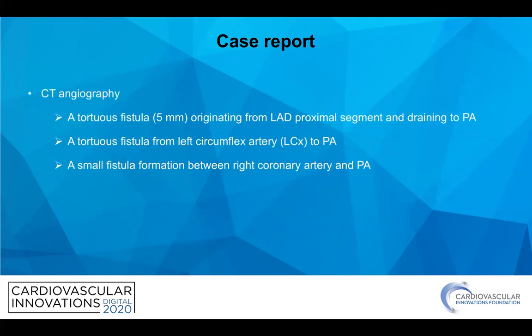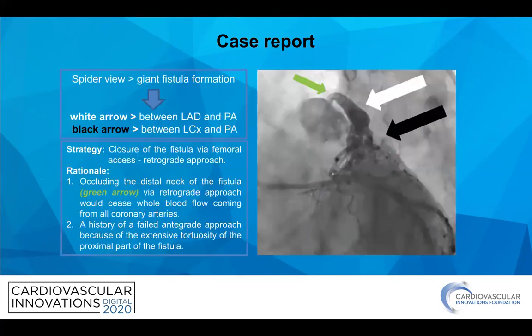CT angiogram clearly demonstrated the complex fistula formation, which was originating from the left anterior descending and left circumflex arteries as well as the right coronary artery, and they were all draining to the pulmonary artery.